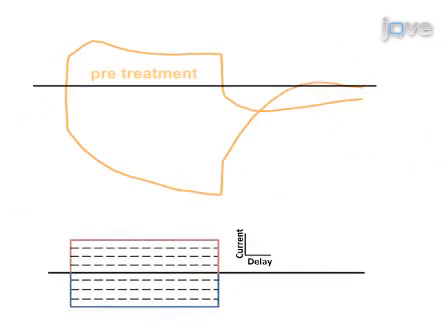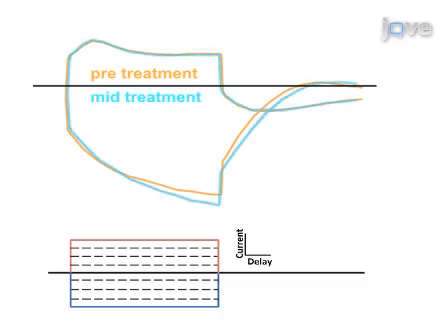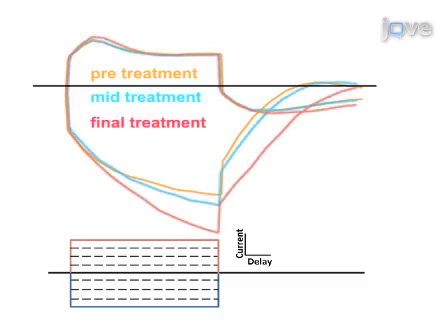Multiple nerve excitability parameters are recorded in response to different stimulus patterns, which assess markers of peripheral ion channel function and membrane potential in order to evaluate nerve function. Results are obtained that show the longitudinal changes in sensory axonal excitability with chemotherapy treatment, and provide a method to detect these changes earlier than conventional techniques.